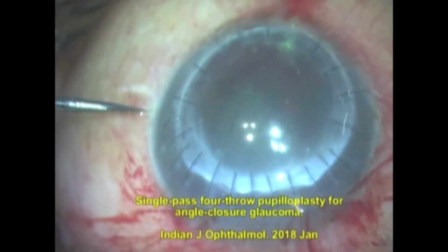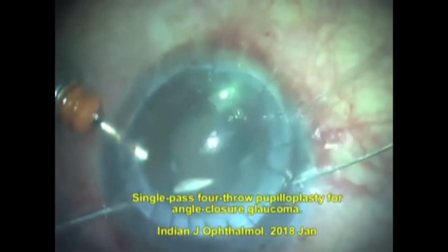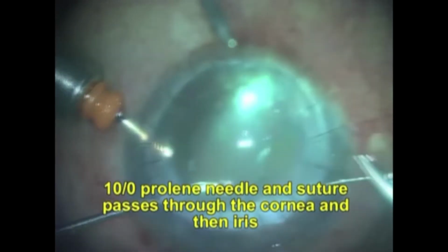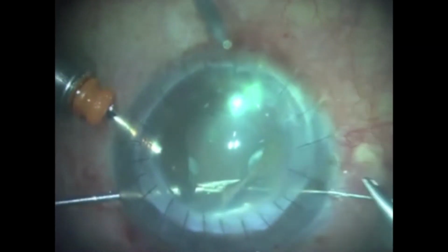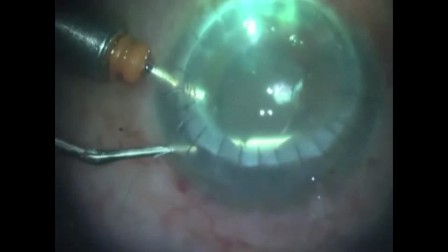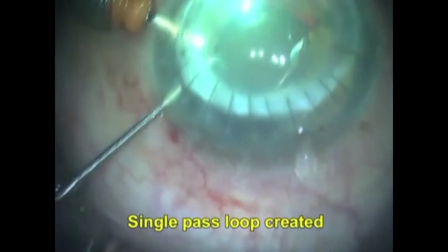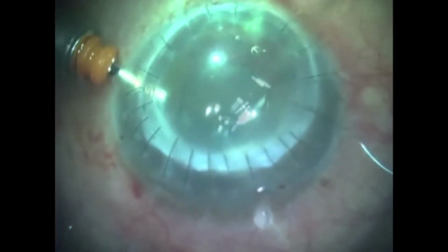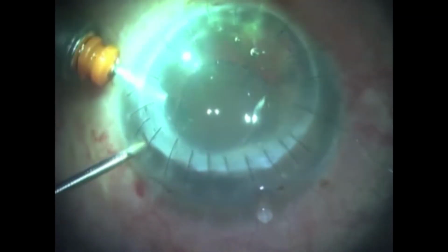Anterior chamber can be maintained with viscoelastic or fluid through an AC maintainer or a trocar AC maintainer. A 9-0 or 10-0 straight needle Prolene suture is passed through the clear cornea and through the iris. From the opposite end, a 26 or 30 gauge needle is passed through a paracentesis and then through the iris.